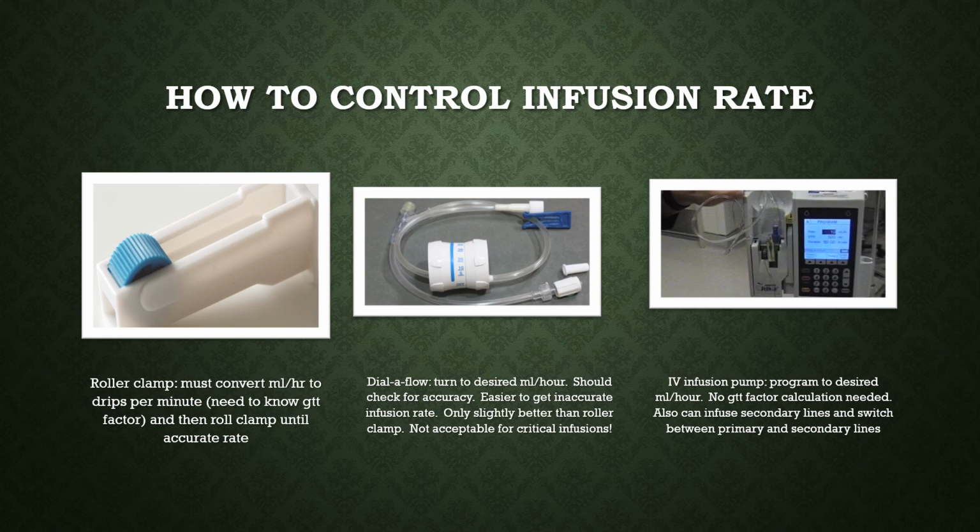It's a connection to the IV tubing. It's to be added to the IV tubing, and it's just about 6 or 8 inches long of tubing. And then you dial the number of the mLs per hour that you want in. 60 ml an hour, 100 ml per hour, whatever, or wide open, or completely closed, or somewhere in between. And it's moderately accurate. So we did use these quite a bit.